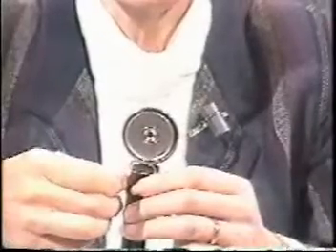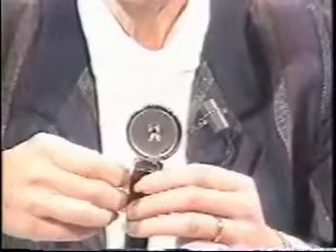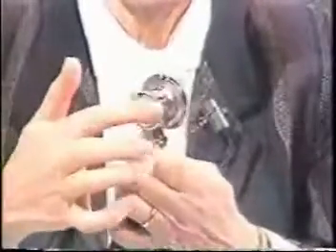Originally, we always used this diaphragm side of the stethoscope to do blood pressure measurements. But more recently, it has been felt that the bell side really provided better low sounds that you might be hearing in the brachial artery. So it's best if you check with your instructor or with your facility to see what their current thinking is on the better side of the instrument to use.